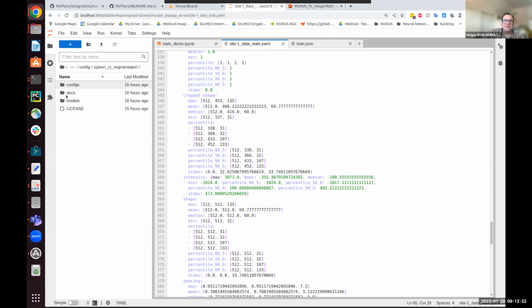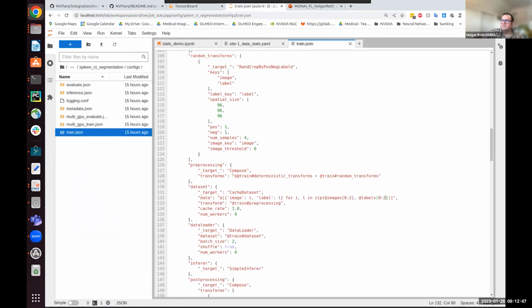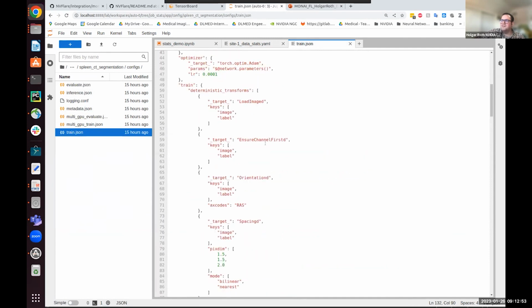In Spleen we don't have any custom code, but there could be a scripts folder here, which contains custom code that you can reference in your bundle configuration. In general, you can just add whatever target path you want here. As long as it's in your Python path, the client should be able to access it.